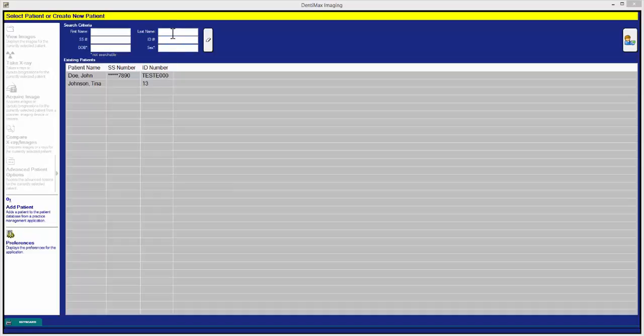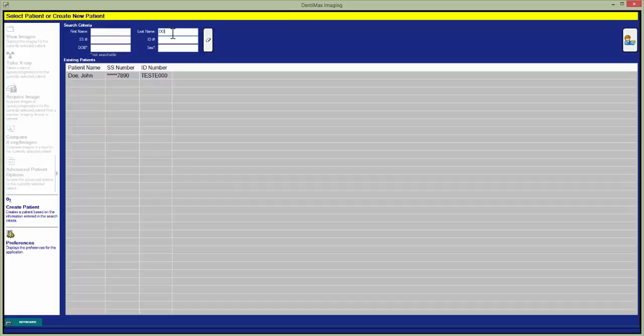You can do this by using a bridge from a practice management software or by typing in a first or last name here in the top and it will sort you to all the people with that same first or last name.